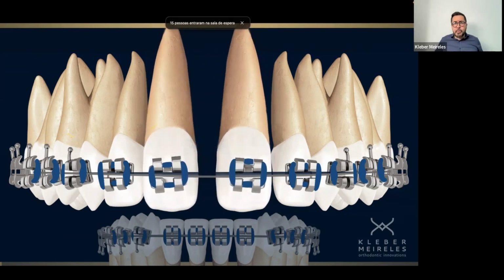Let's try to use our knowledge here of applying just one line of action of the force at the right height. In this case, I can apply this using high hooks. I can make a high hook for that and attach this high hook. For example, I'm going to show you the clinical example of that.